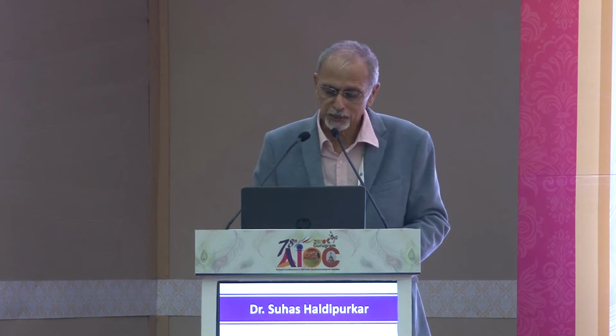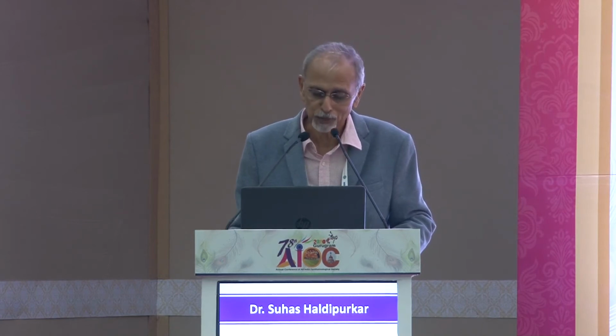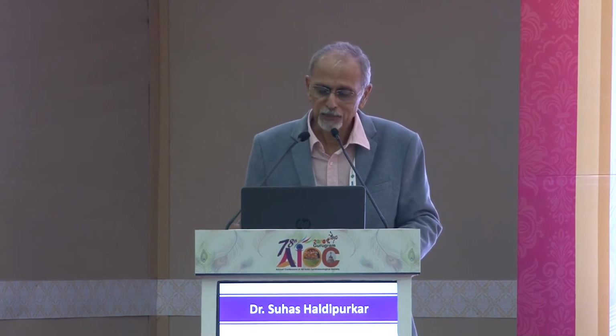Now in this case, what I realize is that there is not much phacodonesis, and that tells me a lot. Here, because there is a lot of anterior capsular fibrosis, I do not want to put any stress on the back, so I use a Zepto and make a rhexis. And fortunately the nucleus is also not very hard, so I try and manage it.